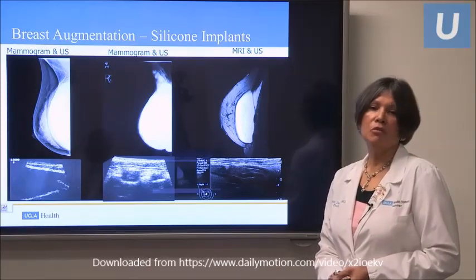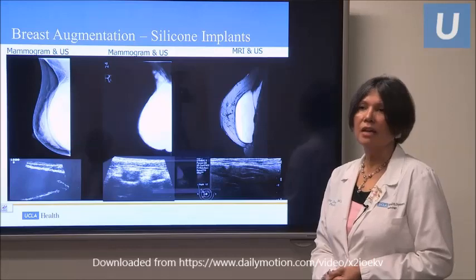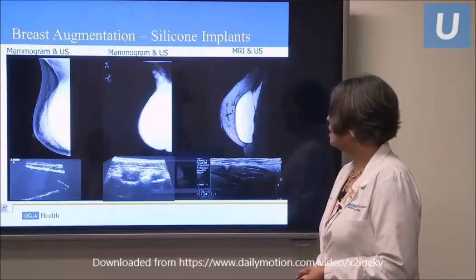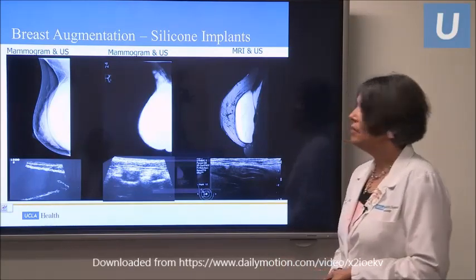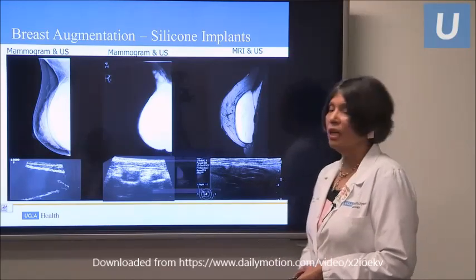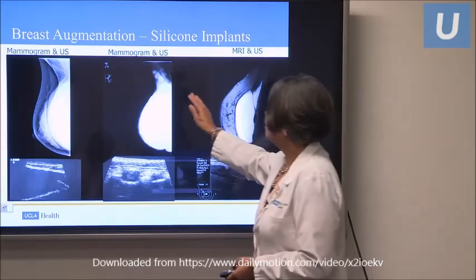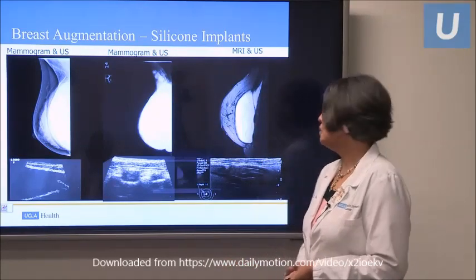So many of the women who are receiving implants now, after the 1990s into the 2000s, received the types of implants that do not have the extent of the silicone getting outside of the fibrous capsule that the body forms around it. But the earlier implants were more liquidy, and therefore the body was walling off the silicone that escaped the actual capsule.